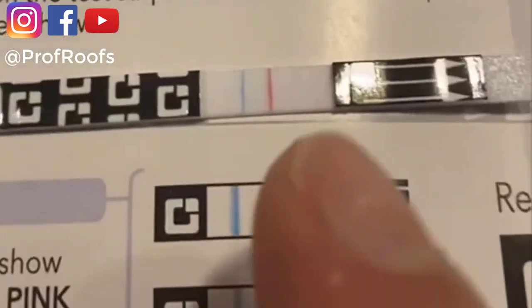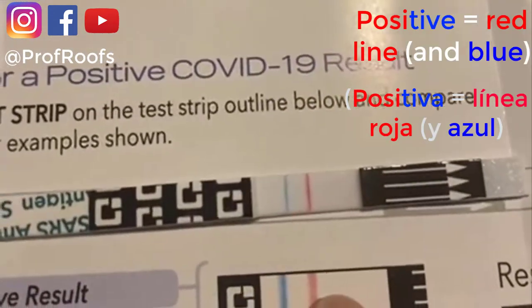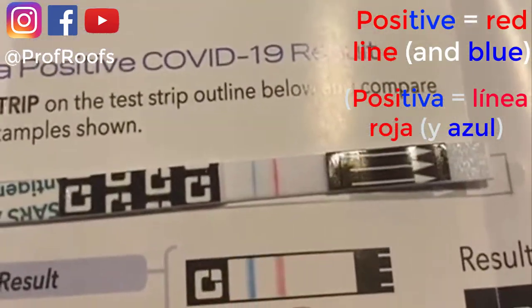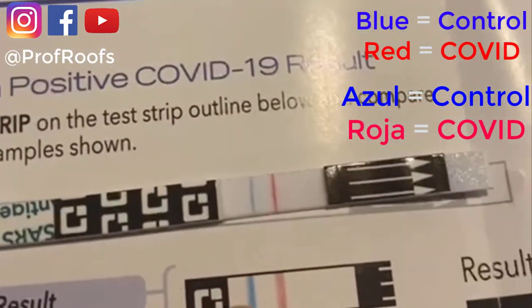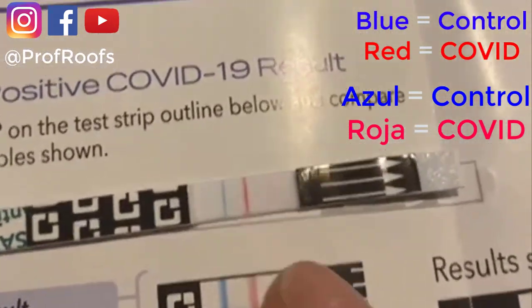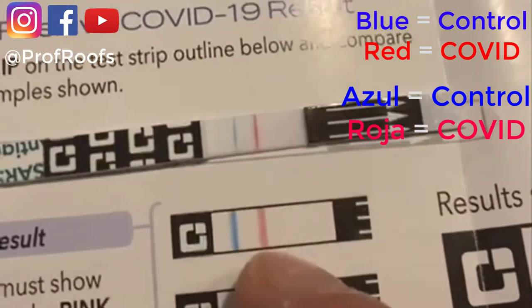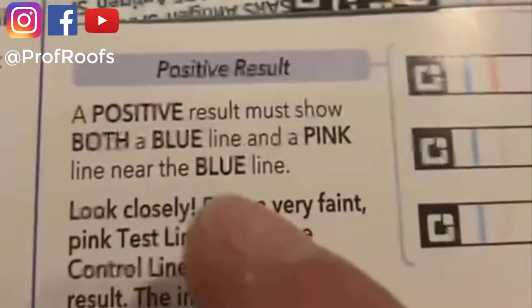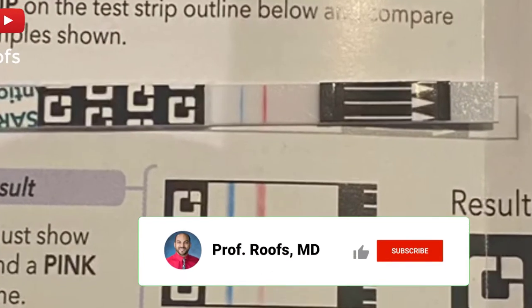Uh-oh. I'm positive, soy positivo, miro, positivo, positive, hay línea roja y azul. Positive is a red line and a blue line. A blue line is a control, so a blue line siempre hay línea azul. Pero red line, la línea roja, rojo es COVID. Uh-oh. No bueno, positive, tengo COVID, no, no sabía.